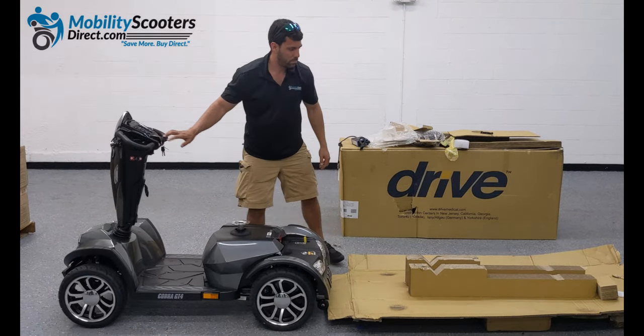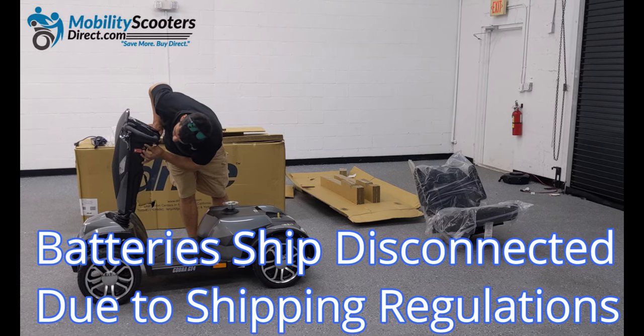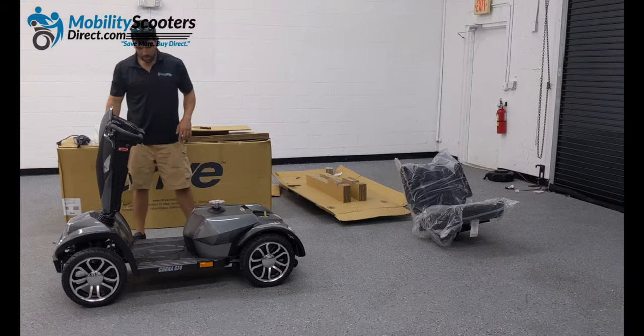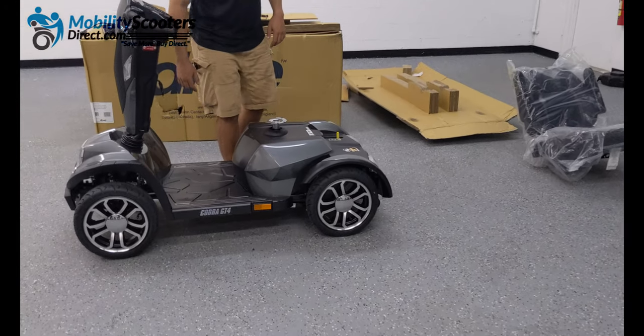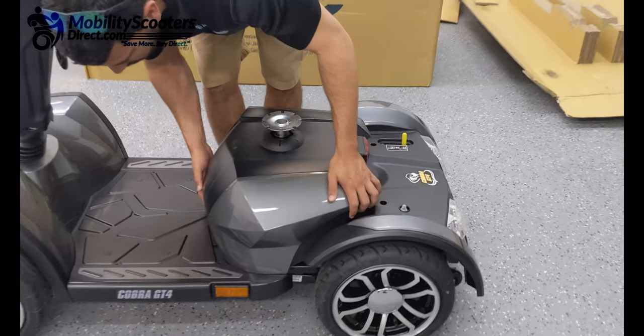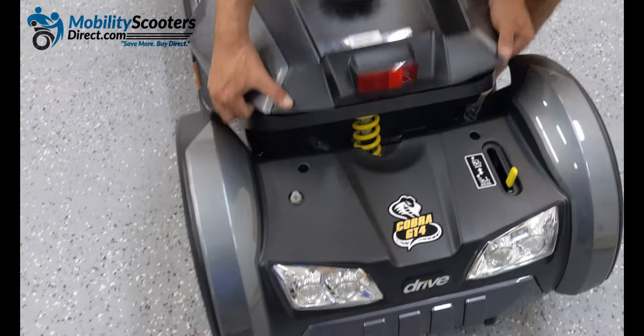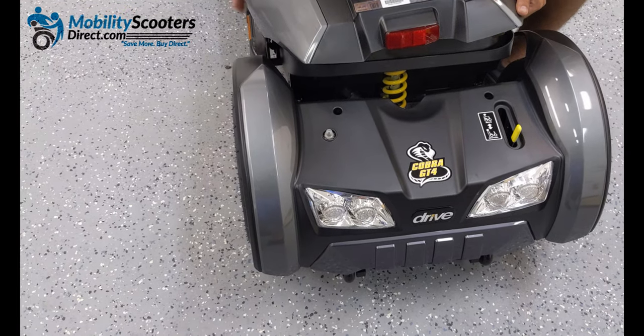Keep in mind the unit does weigh approximately 340 pounds with the batteries, so it's very heavy and we don't recommend doing this alone. Once you have the unit out of the box, you can move away the boxes and get ready to connect the batteries.